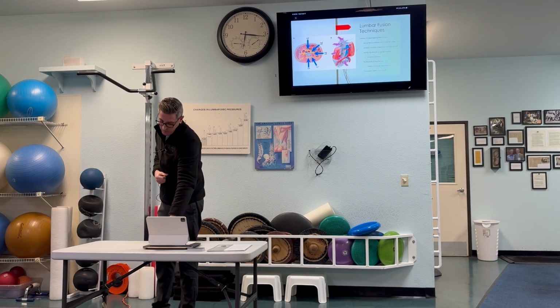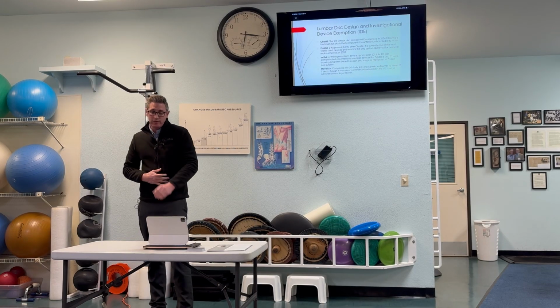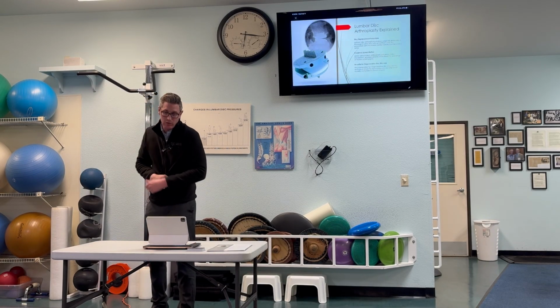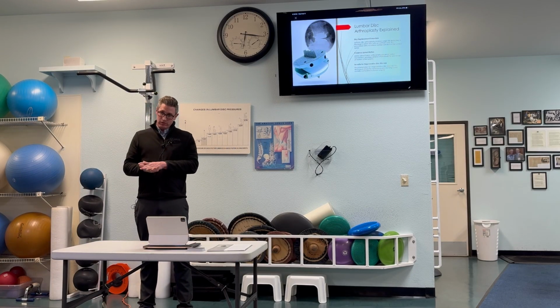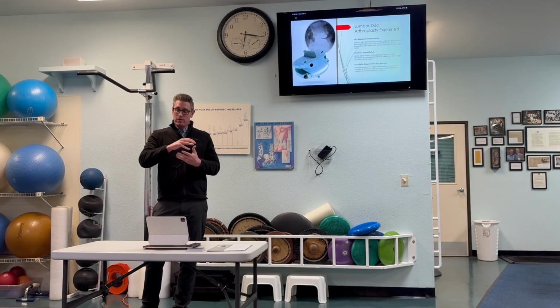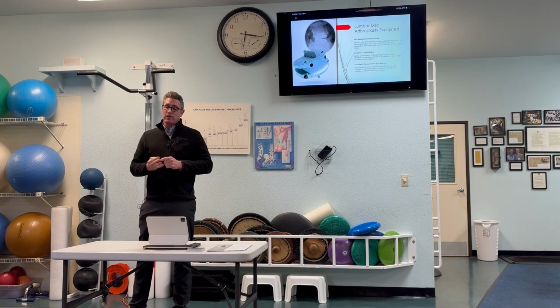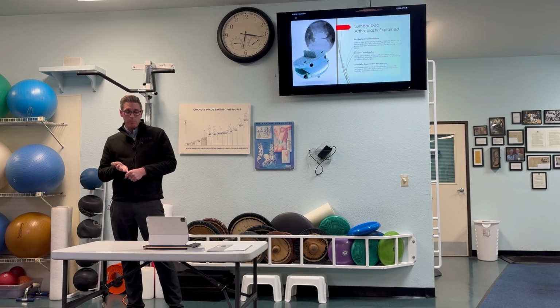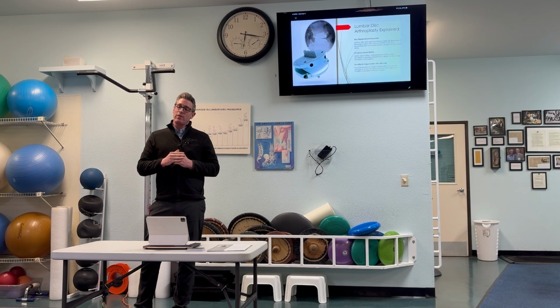between those segments. With regards to the lumbar disc arthroplasty, I think this slide's a little bit backwards. With regards to the lumbar disc arthroplasty, this is more of a motion preserving procedure. So this does not gain motion necessarily, but it will preserve the motion that we have. Whereas with a spinal fusion, we're actually removing the motion of those segments that we're fusing. So this is really beneficial in that this can maintain the range of motion for a patient at that particular segment. And probably one of the biggest advantages is that there's a decreased likelihood of having adjacent segment disease.